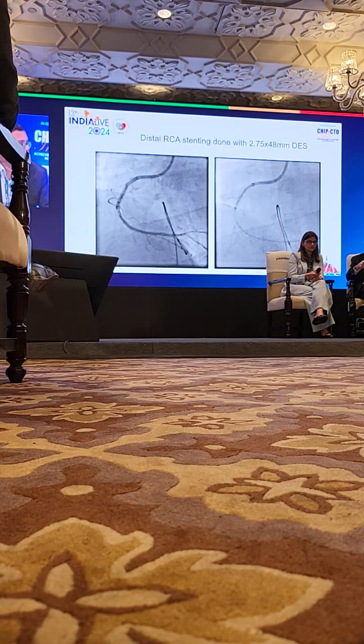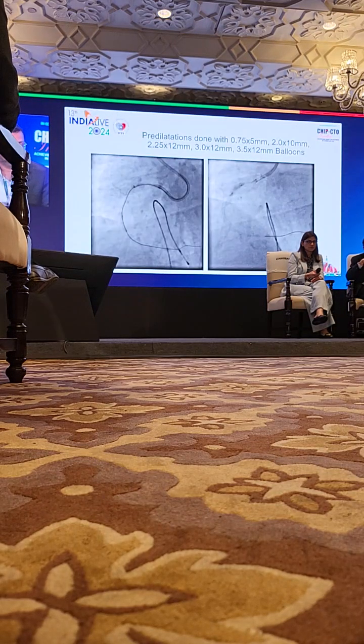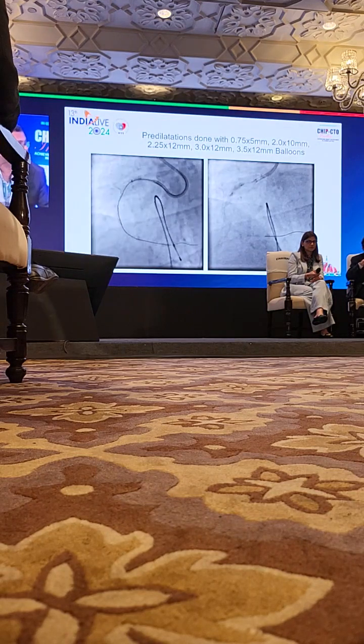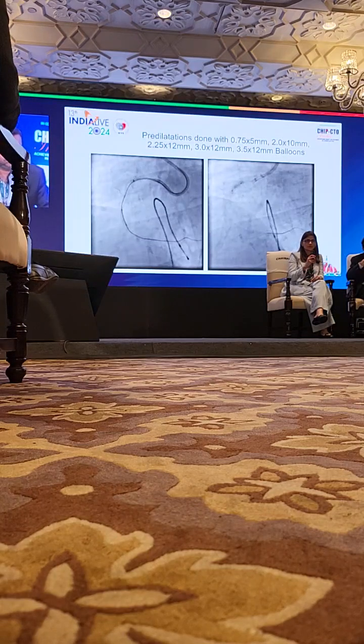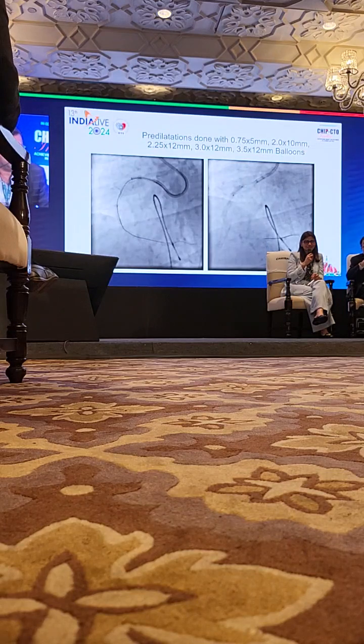Go back one or two frames, only the proximal RCA. This is the one where you started reflowing, afterwards slowly. So the guide was heavy actually. If you see here, the guide was.